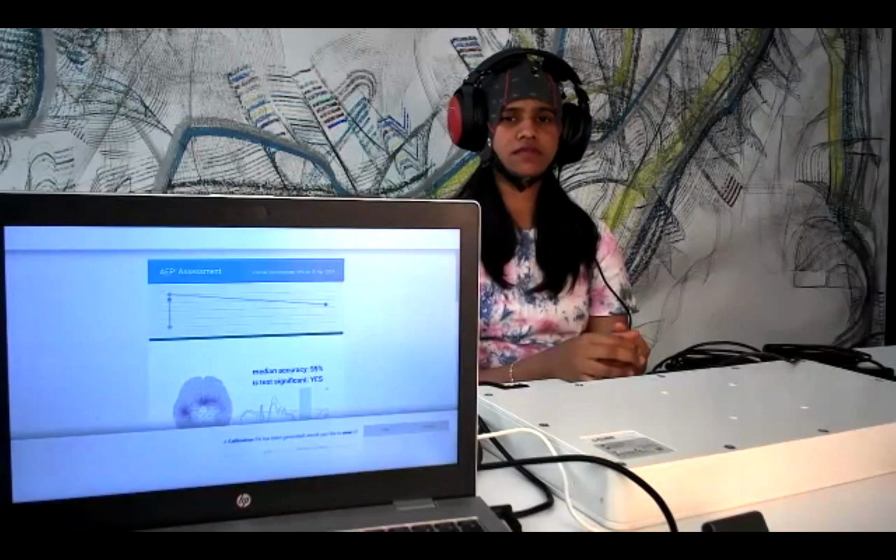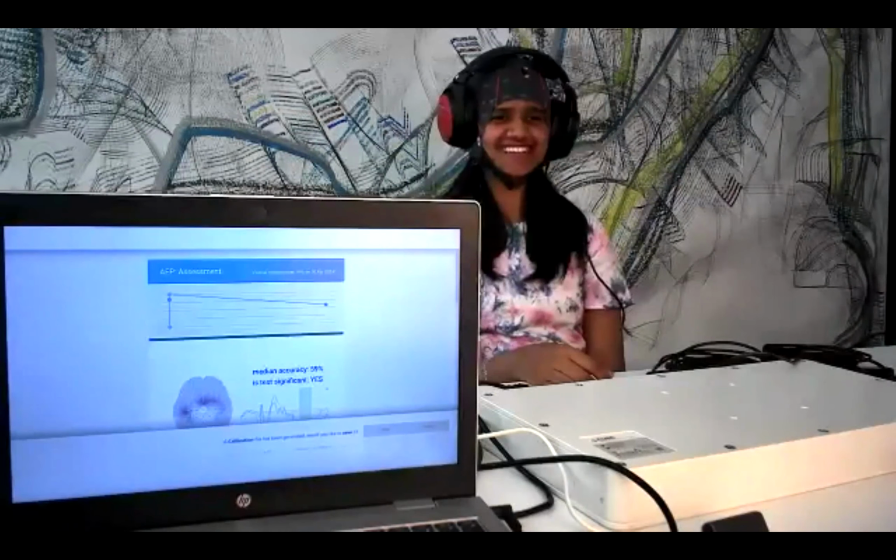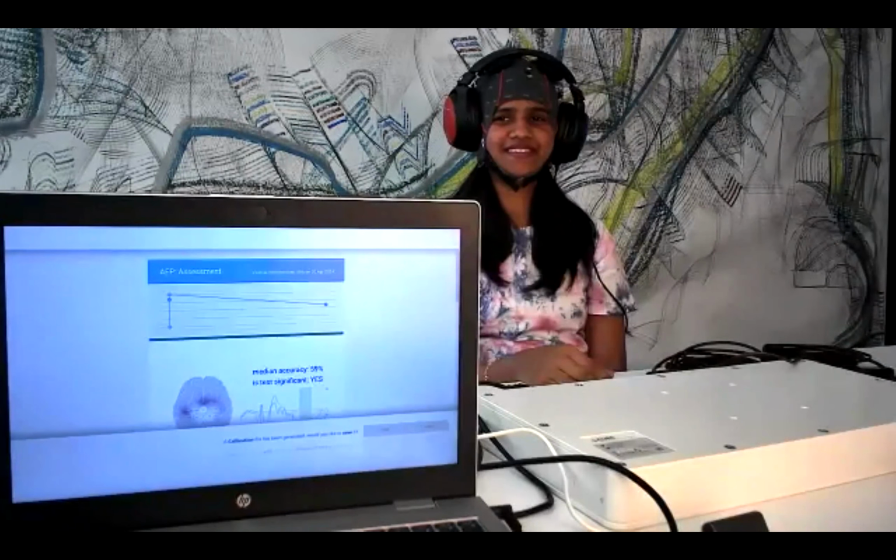We have an accuracy of 59. It's not perfect. I think the participant is a bit nervous or is getting distracted because I'm working and talking for some additional time.